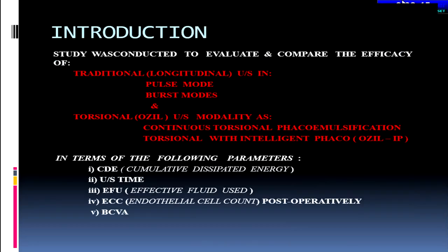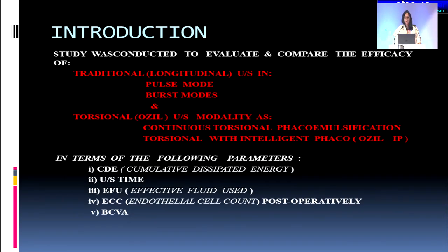So now one would think why this study is being conducted. It is being conducted because not all the machines have the OZil and the OZil IP or the elliptical modes of phacoemulsification. But the burden of cataract, as we know, is a huge burden. So not every machine has that modulation, so we need to know what is best for us, that is available in the machines.